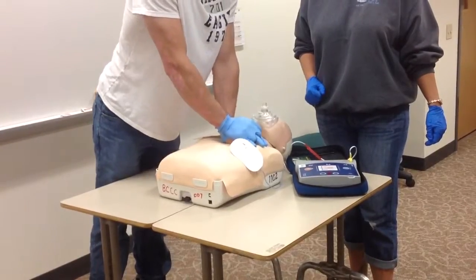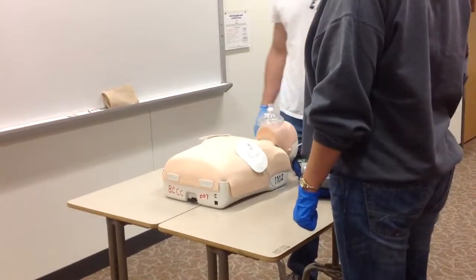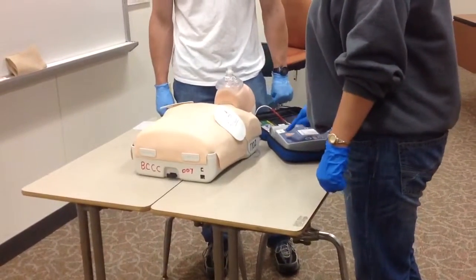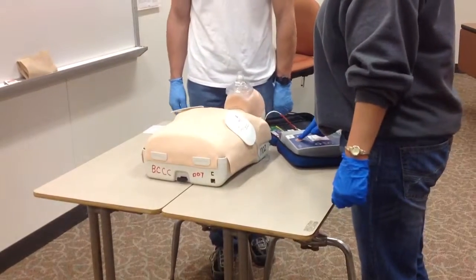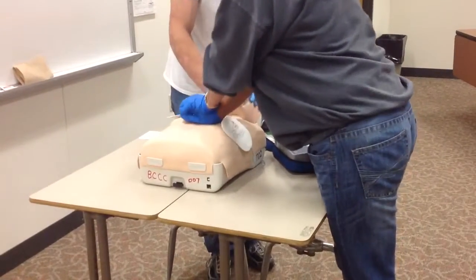Analyzing heart rhythm. Stand clear. Do not touch the patient. Shock advised. Charge. Clear. Stay clear of patient. Deliver shock now. Shock delivered. Paused. Begin CPR.